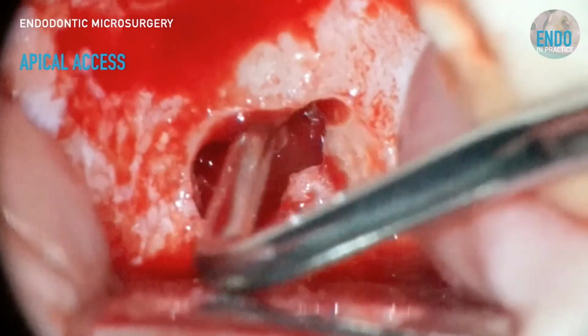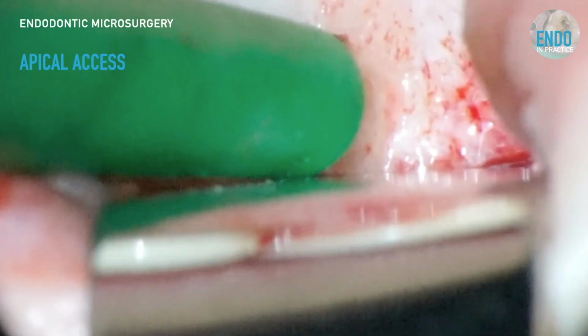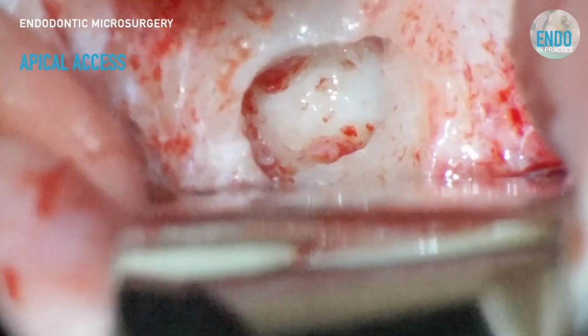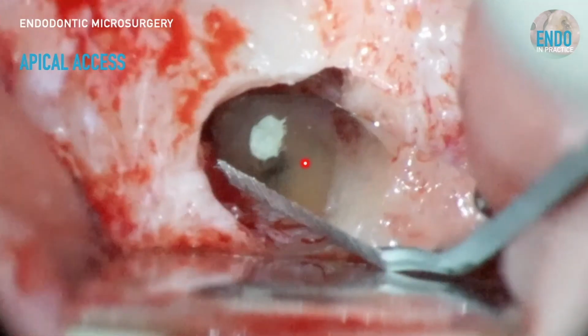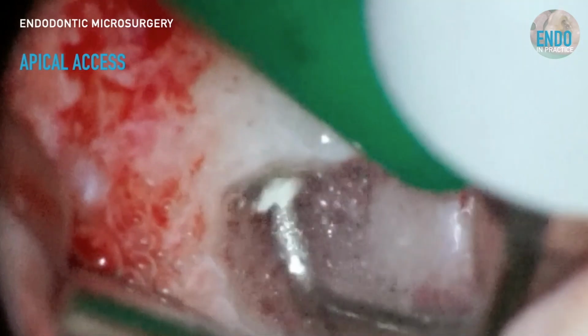To debride it effectively and not leave tissue strands will help you with hemostasis. Can you see how it's dried up nicely? So if you leave soft tissue tags, you'll leave little bleeders within the crypt. But you can see quite clearly there the chromogenic staining of the root canal system. So you know you're onto a winner already.